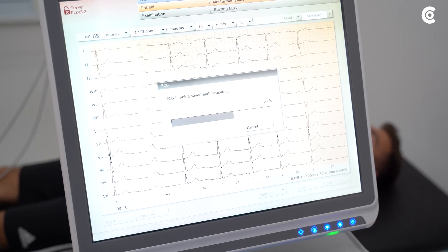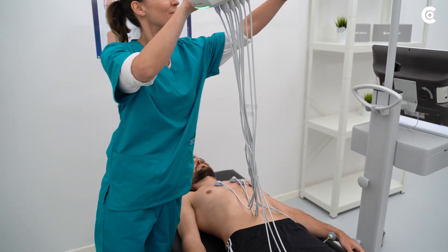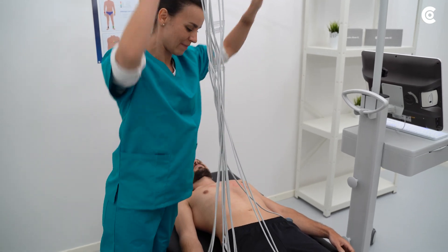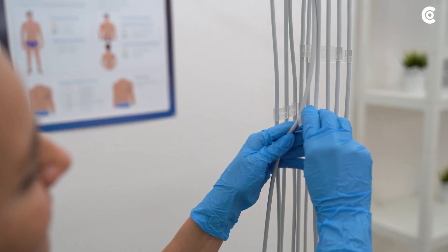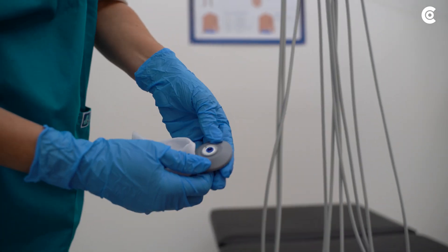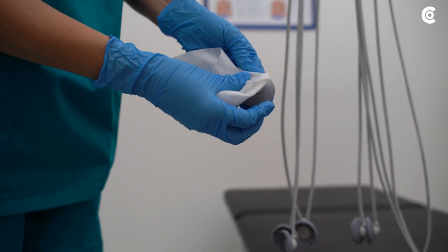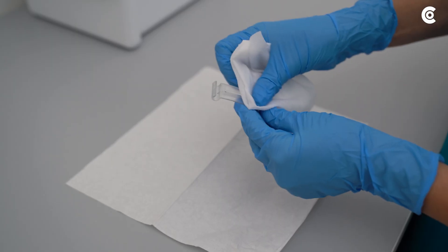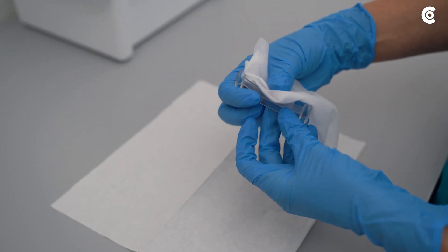After the measurement, Cardio 400 goes to the detachment mode. The suction lines are cleaned from inside to a certain extent. Remove dirt residues and disinfect the cables and electrodes from outside. You should carry out a major cleaning and disinfection from time to time. To this end, observe the information in the user manual.